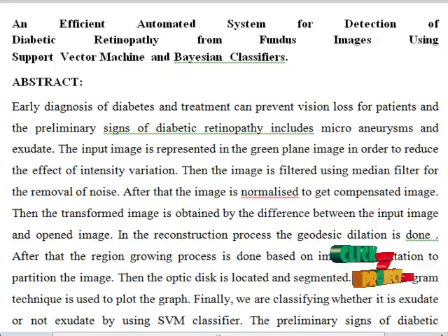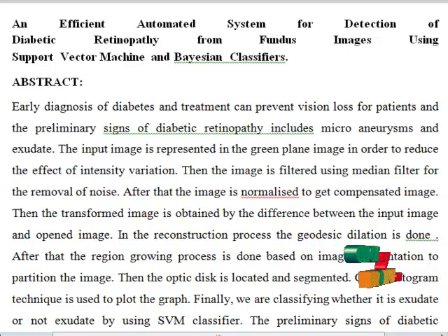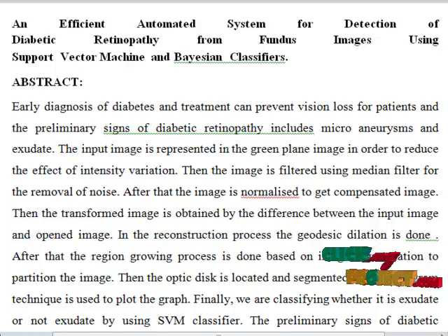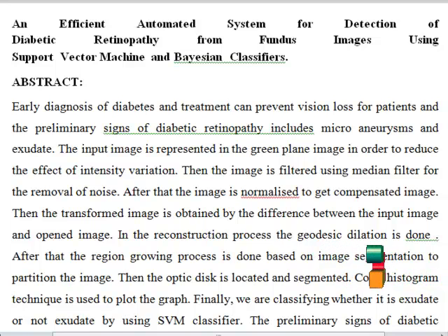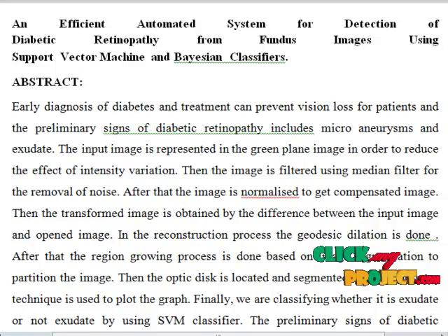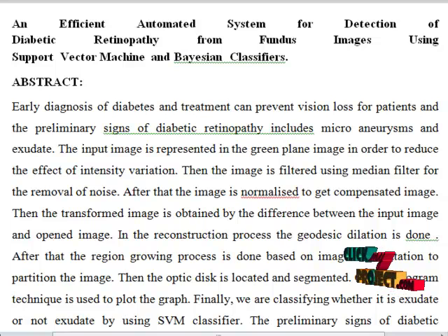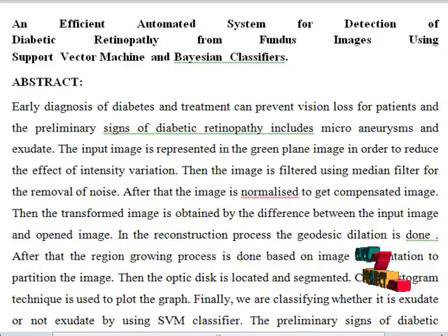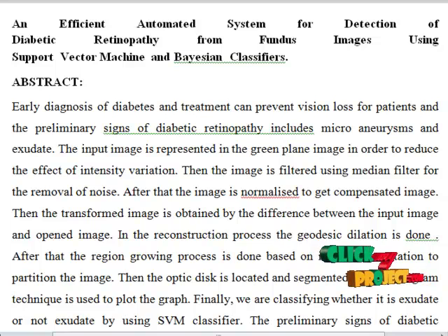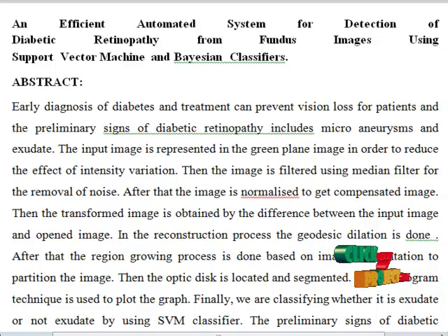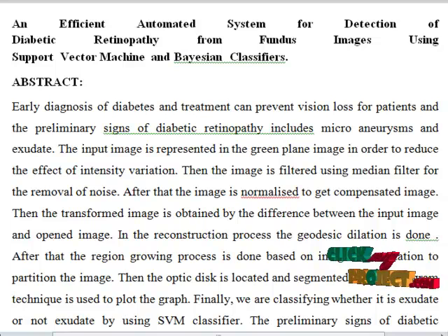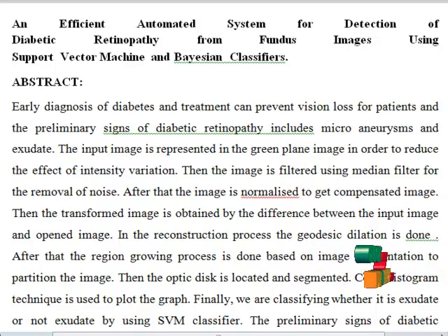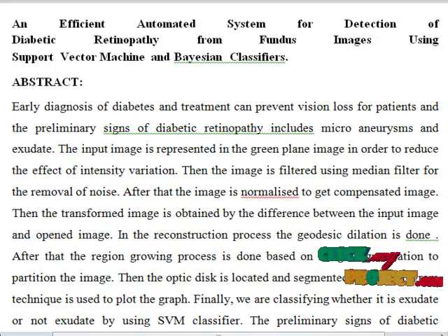We are classifying whether it is exudate or micro aneurysm by using SVM classifier. Diabetic retinopathy occurs when it damages the tiny blood vessels inside the retina in the back of the eye. For the detection of micro aneurysms and exudates, we are using SVM classifier. Diabetic retinopathy affects up to 80% of all patients who have had diabetes for 10 years or more. The advantage of this process is that computer aided detection of exudates will give fast and precise diagnosis.